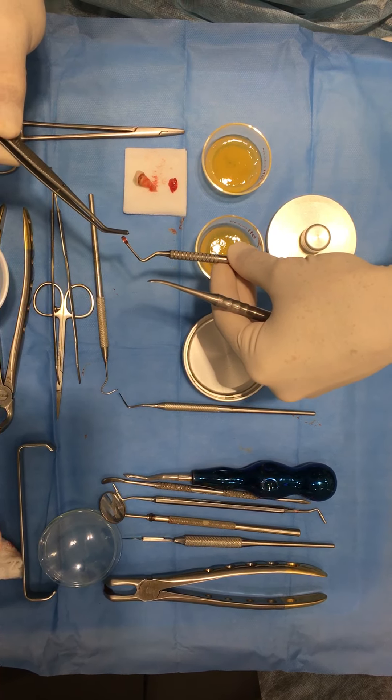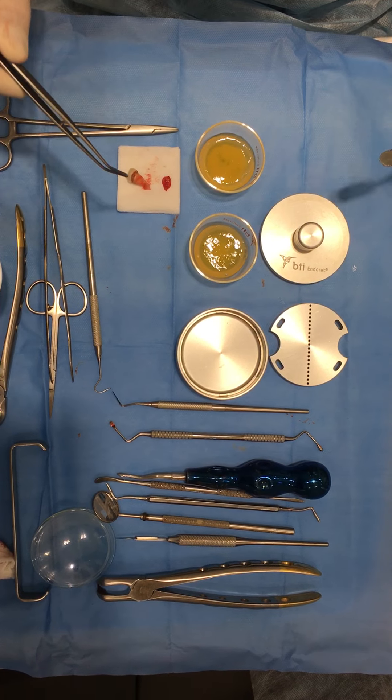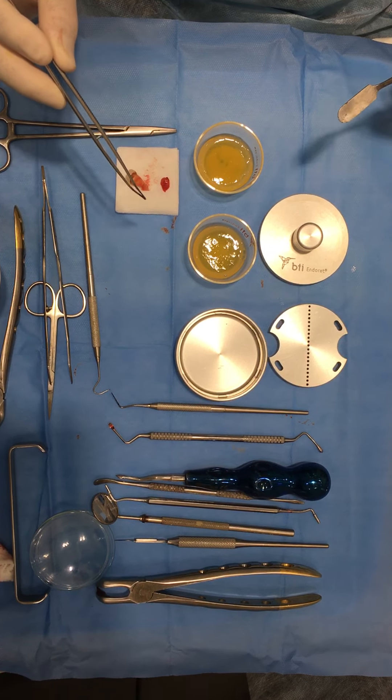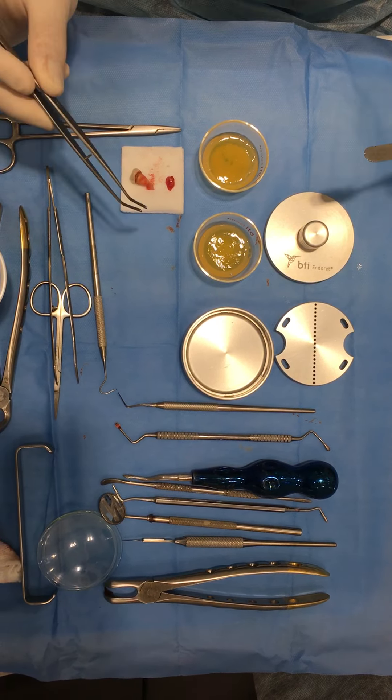Once we make sure that this cyst was removed, we have to sound the bone and feel that the bone is hard, so there is no remnant cyst attached to the hosting bone.